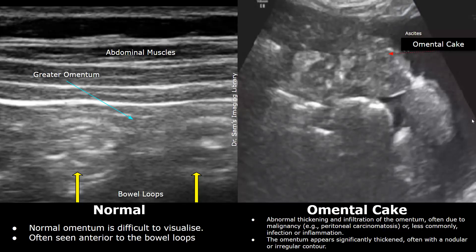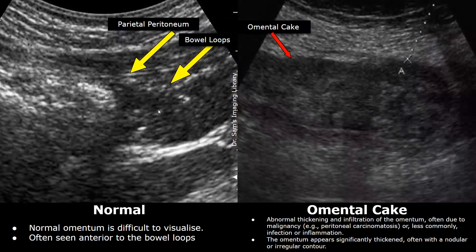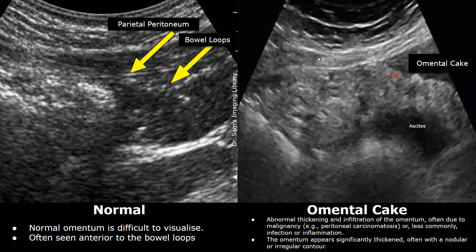Basically, in normal cases, we will not see any heterogeneous and large prominent structure in the abdomen, usually anterior to the bowel. This image also shows an abnormally thickened omentum, with no ascitic fluid present in this case. In this case, the omentum appears hyperechoic, heterogeneous, and has irregular margins.